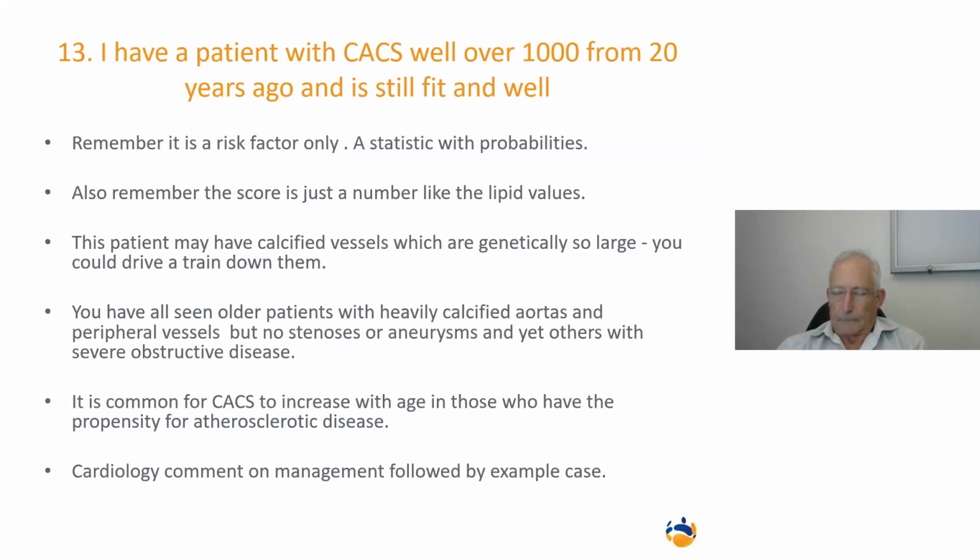Blood pressure control, cholesterol to target, watch out for weight gain, manage his sugars. And if you are concerned, this is where a functional stress echo or MIBI study is very valuable. But in this clinical scenario, I think he would easily cope with a functional test, and he is for medical management, and he can be reassured.